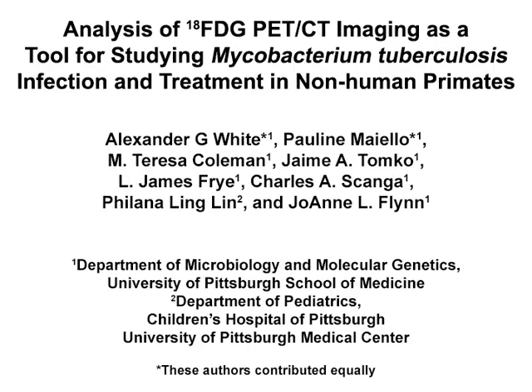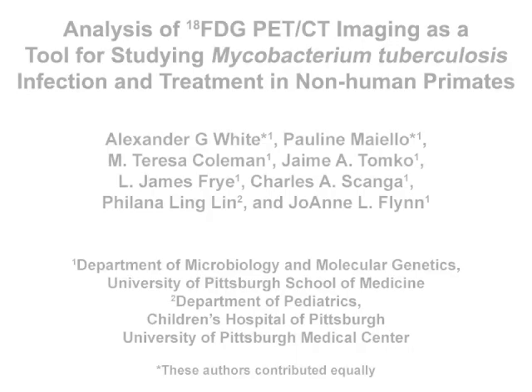The overall goal of this positron emission tomography computed tomography, or PET-CT, image analysis procedure is to study the disease process and potential treatment methods of Mycobacterium tuberculosis infections in non-human primates. This method can help answer key questions in the study of tuberculosis, including infection location over time, the reactivation from latency, and the outcome of specific treatment regimens.